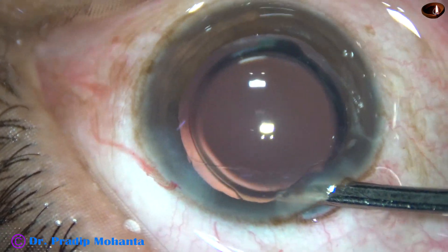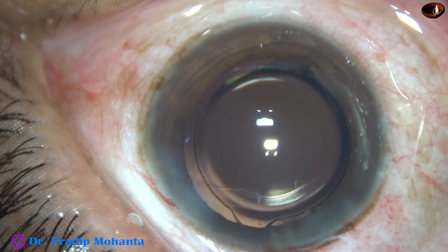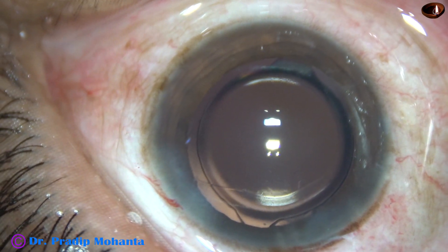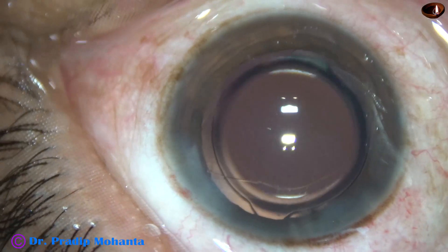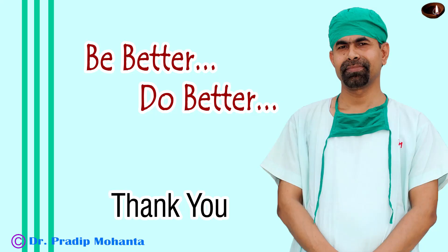And now the anterior chamber is formed very nicely. Integrity of the wounds is checked — there should not be any leakage from any side. A few drops of moxifloxacin are applied and the case is concluded. Thank you very much for your attention. Hope this video will help you in developing your surgical skills. So if there is rhexis extension and if the nucleus is soft, we can proceed with FACO. Be a great surgeon and serve your patients with love, respect, empathy, and great surgical competence.